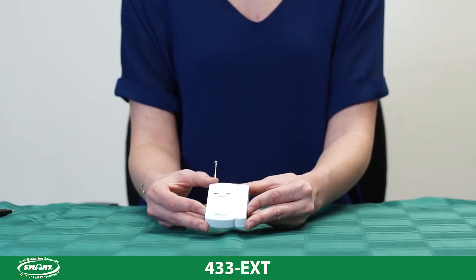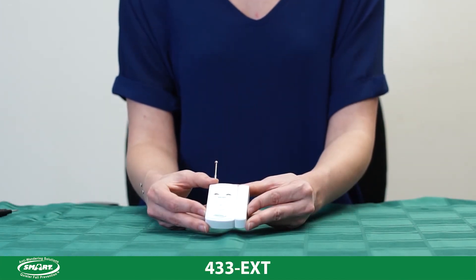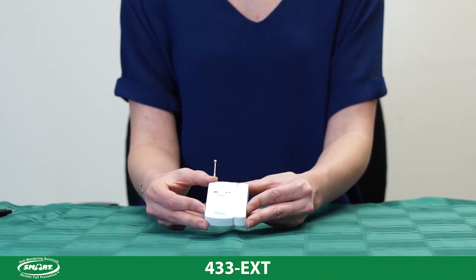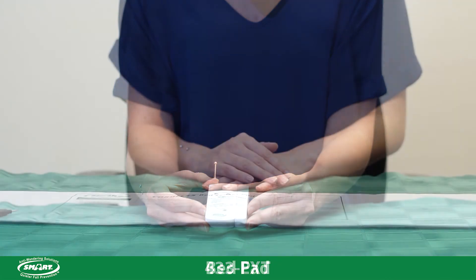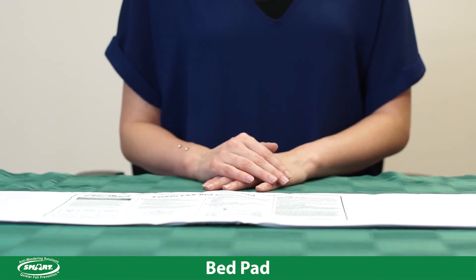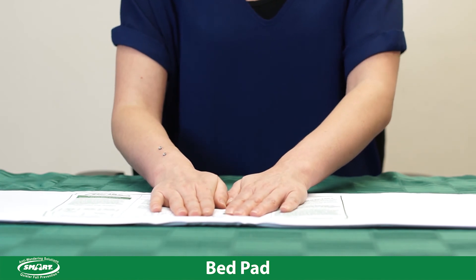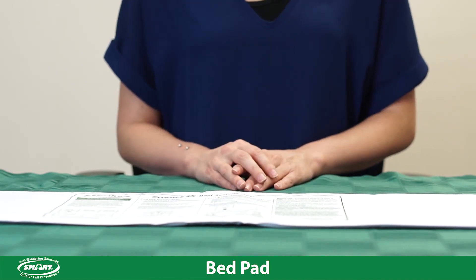To activate the 433 EXT for programming, simply remove the two pieces apart from each other. Wait two seconds and then realign the two parts so the arrows are touching again. To activate your pad for programming, take your pad and place pressure onto it for two seconds, then remove pressure from the pad. This will activate the pad and send a signal to the receiving monitor.